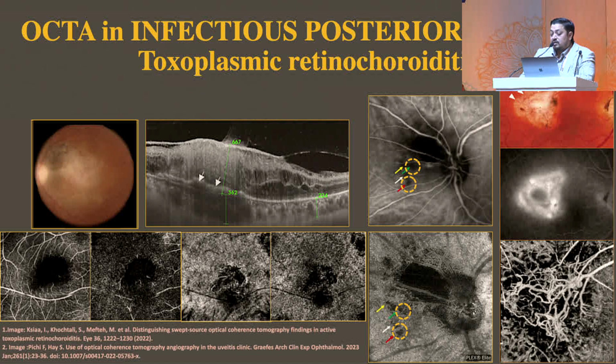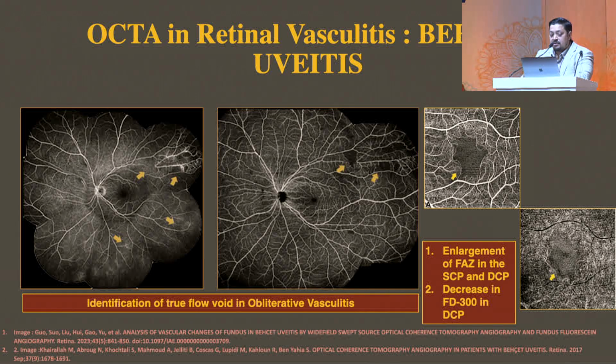And at that same time, if you do an FFA, you might miss those small satellite lesions. But you do an OCT angio, look at those yellow circles below in the image. You will find that you can clearly see those satellite lesions. So if this patient is coming to you in later stages when he is healed, although for a good clinician it is a CNVM complex, if you're in doubt, you tend to do an FFA, but just don't do an FFA, do an OCT angiography and you can see a CNVM complex.